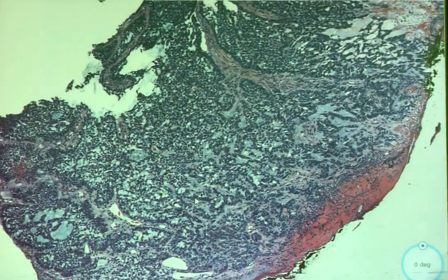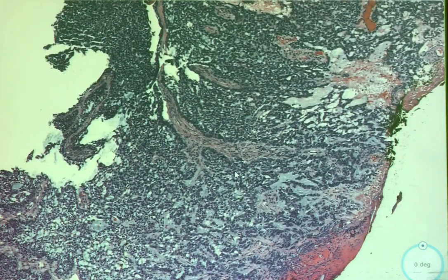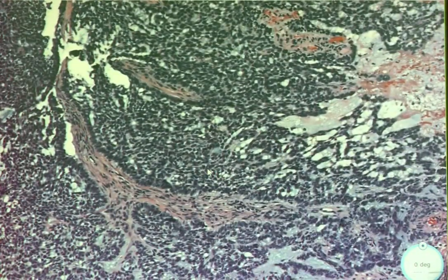Okay, does this look at all like the previous lesion that we had? Yeah, it looks like it. So I probably just gave you a different variant, right? That's because I did. It looks like it, but it's not at least a bit organized. Like here you can see the palisading, but it's very focal.